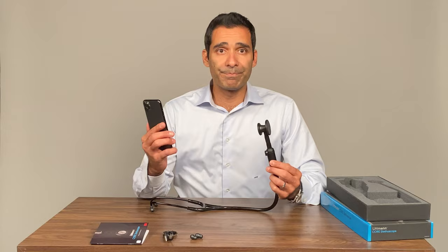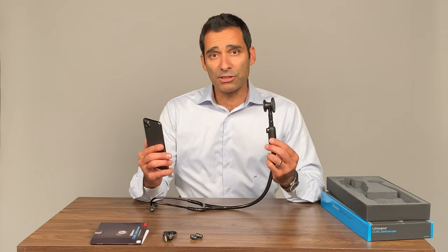I can pair it to my ECHO app on my phone. I can auscultate a patient, get a clean recording, and inspect the waveforms right on the screen. I can subsequently share these with my primary care physicians and use them for teaching purposes.